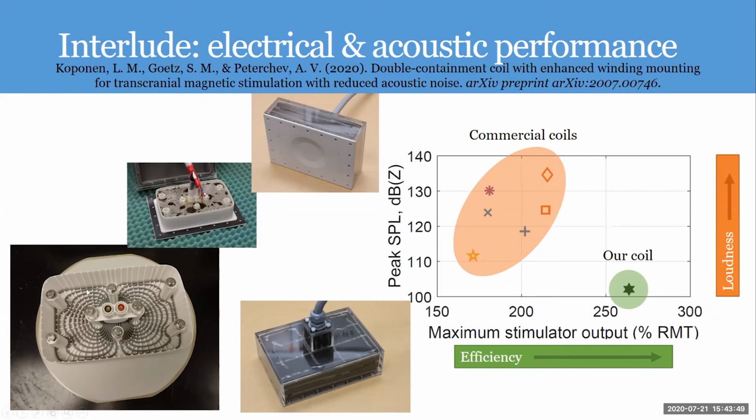And that's a printed mold from laser sintered nylon in this case, with the wires clipping into the places where they should, and with the least amount of material, so that the epoxy can fill everything, because epoxy, by a factor of 4 or 5, even vanilla epoxy, is stiffer than the nylon.